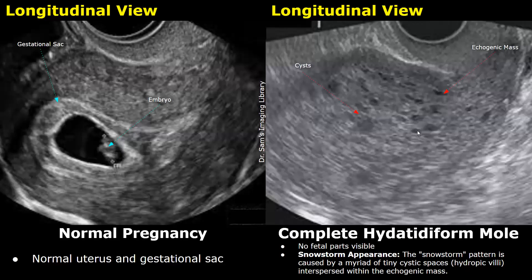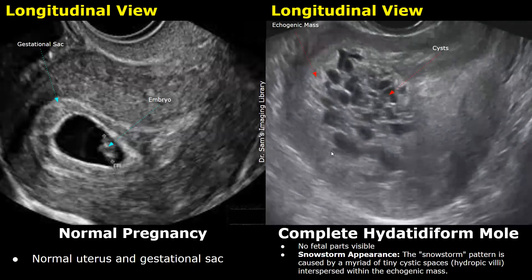This type of appearance is termed a snowstorm appearance. The echogenic mass is filled with cystic spaces. Here is another image showing a complete hydatidiform mole — we see a large mass filled with multiple cystic spaces, and no fetal or embryonic parts are seen.